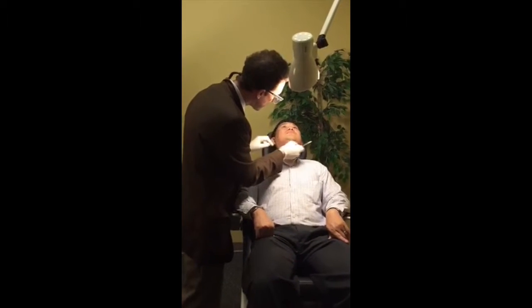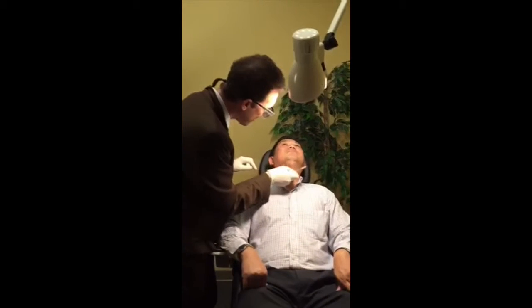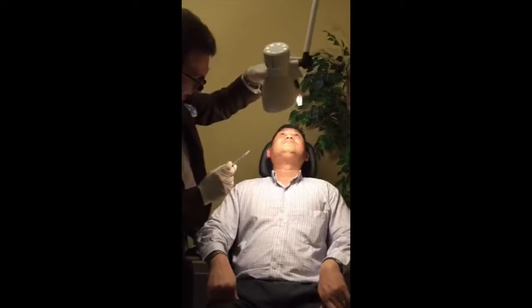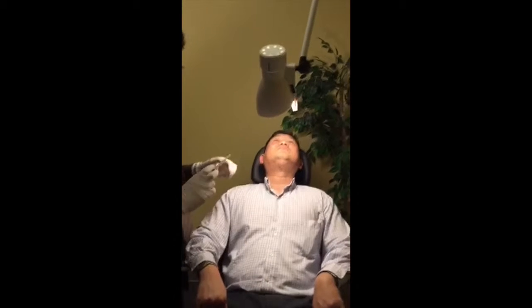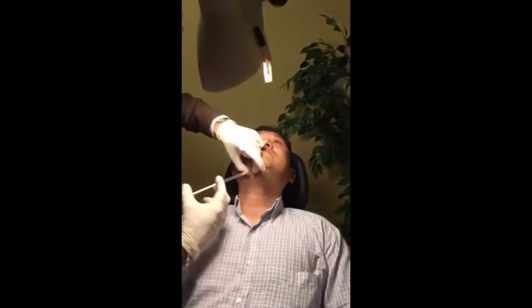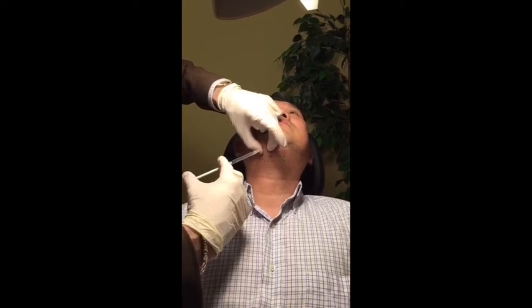The question is, what is this injection, Dr. Scheiner? So this is something called Kybella, and it is an amazingly new FDA-approved injection that allows us to melt fat without surgery underneath the skin. So he's been numbed already. I have these funny markings on him because this tells me exactly where I have to inject. It's very precise. And so what I'm going to do is I'm going to pinch here, and then we inject 0.2.